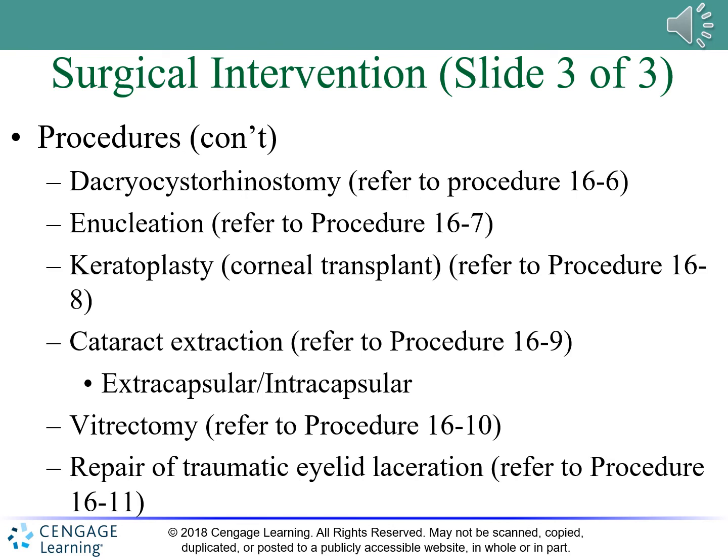IOLs are small prescription lenses placed inside the eye for clear lens replacement surgery. IOLs may be foldable or hard. Foldable lenses are made of silicone or acrylic and can be rolled up and placed inside a tube that is inserted through the small incision or folded by locking forceps, and once inside the eye, the IOL unfolds. Hard plastic lenses are rarely used and must be inserted through a larger incision.